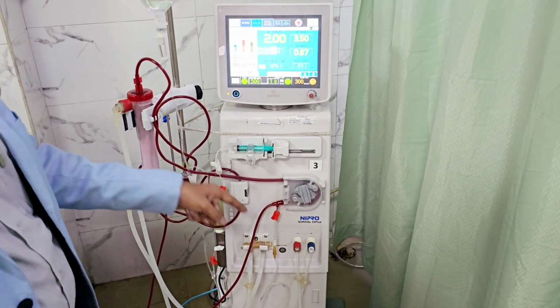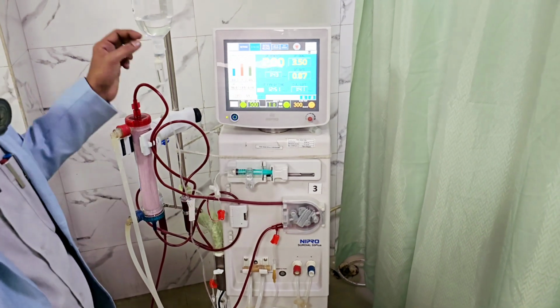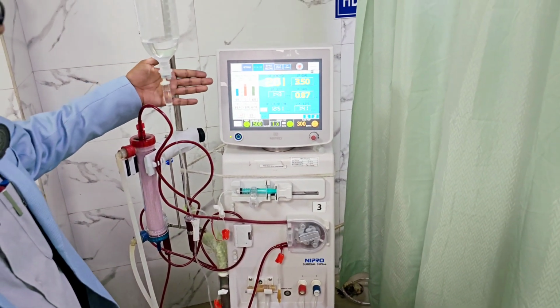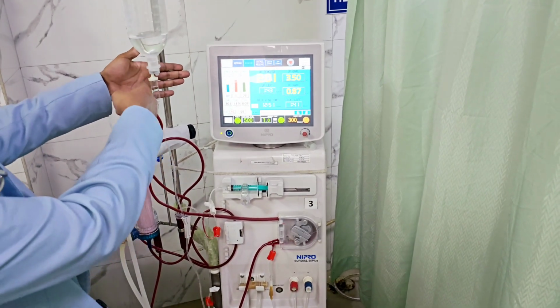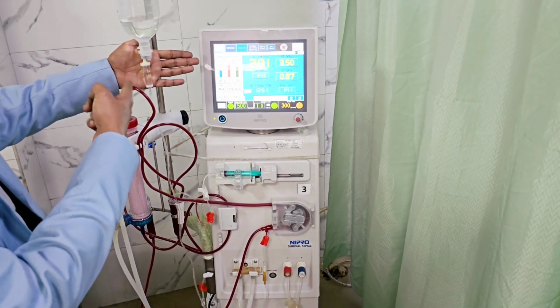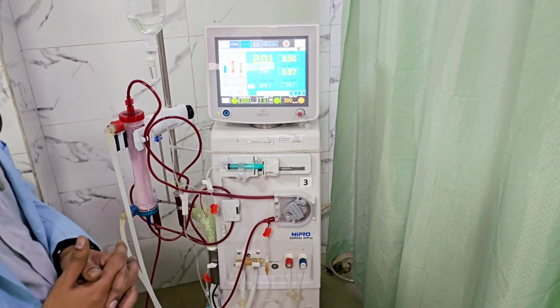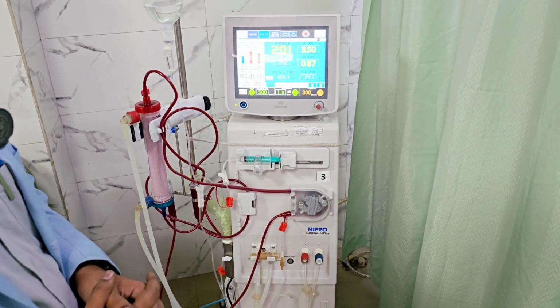Once I open this clamp, the pre-pump normal saline clamp, the NS comes very fast. This you can notice over here. Suppose if I open that one, you can see how fast the NS comes in to dilute it. Now I didn't open it. If you open it, it will come very fast. So this is all regarding the heparin-free setting in hemodialysis.